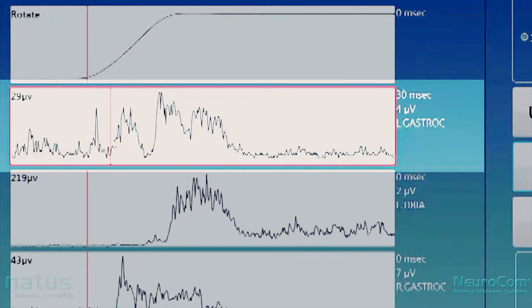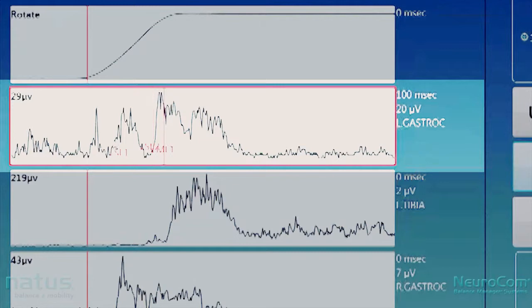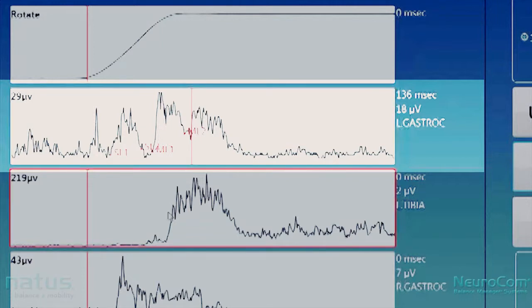Highlight the channel of interest and scroll across until you identify the takeoff point. On left gastroc, we're looking for the takeoff point of the short latency response, which should occur somewhere around 30 milliseconds. Looking at the microvolt measure, you can see where it starts to rise and continues to build — find the floor of that response, mark it, and move across until you identify the end of the response. Continue scrolling on the left gastroc channel to find the medium latency takeoff point. Note that there may be crosstalk from the left tibialis channel, so it takes some experience to identify the true response from noise.